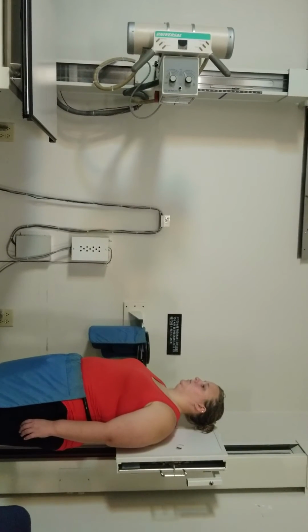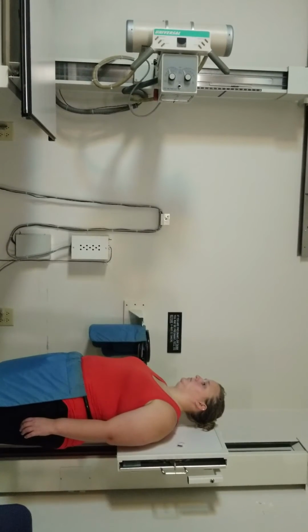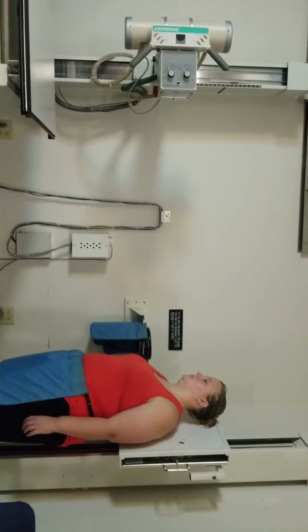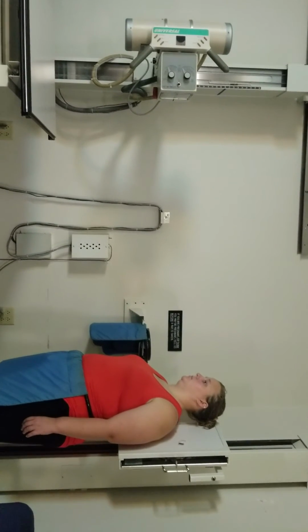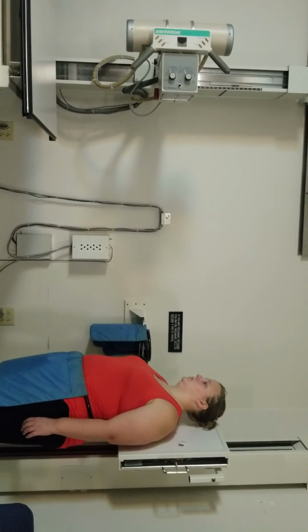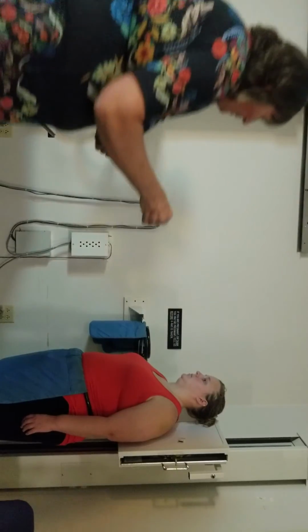I didn't get my markers ready beforehand. I'm going to find the marker that says with weights. Maybe it's on mine. Weight bearing. That one's close enough. I'm going to leave my mass alone. The only thing different I'm going to do with this one is add a weight bearing marker.